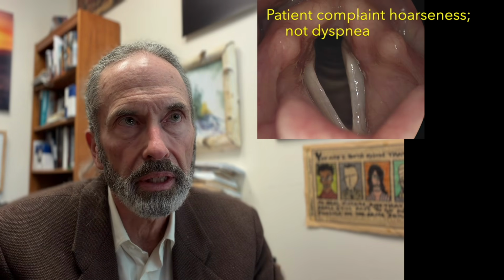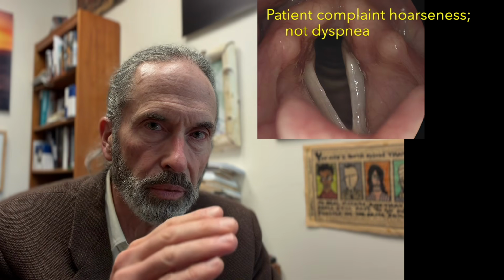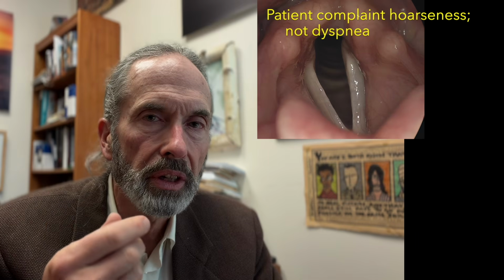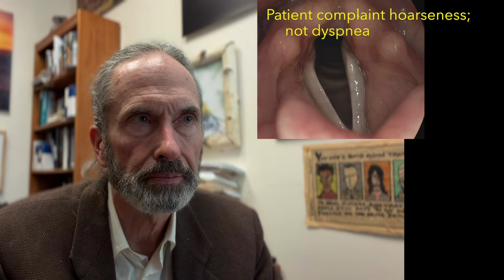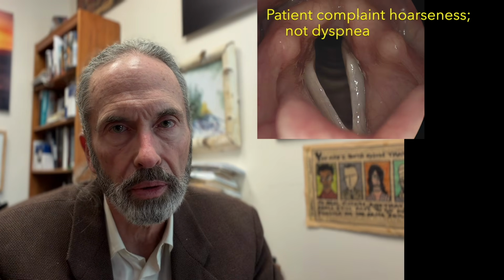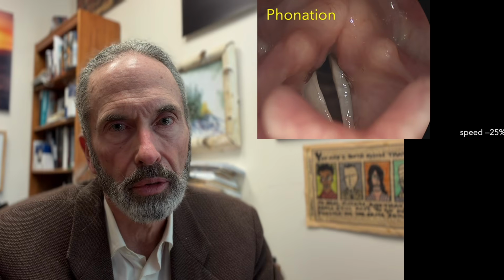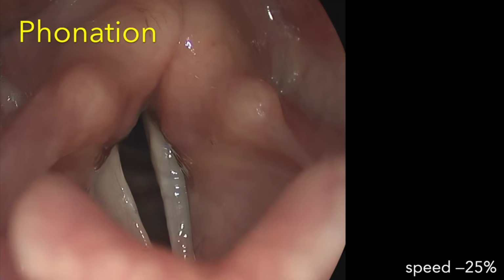Really, the patient complaint is about hoarseness, not dyspnea. So for this particular case, we're actually not worried how far out it goes to the side. We want to know what it does when the LCA activates for phonation. In a way, we can ignore that the left vocal process doesn't open all the way. So our second task is to look at the vocal process during phonation. Let's watch this slowly and over.